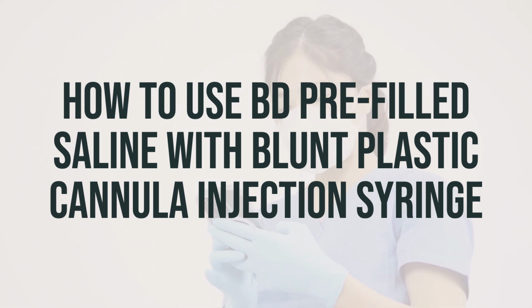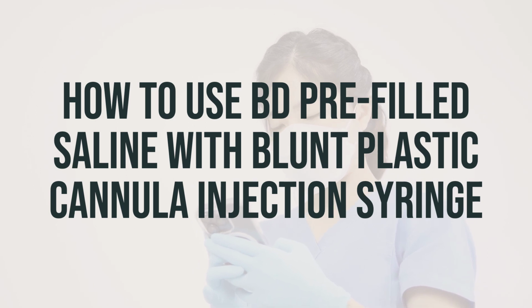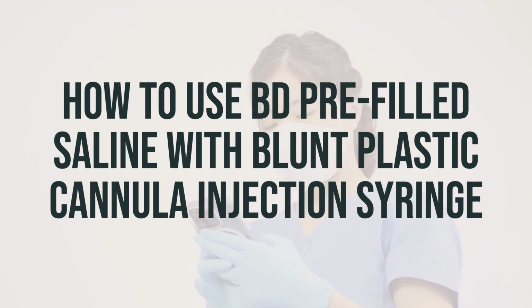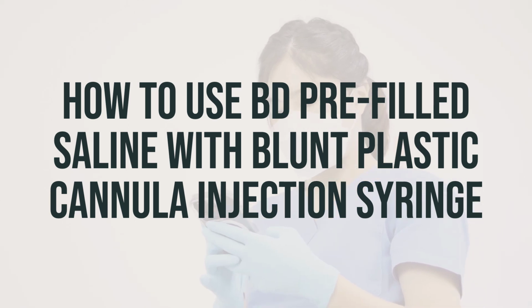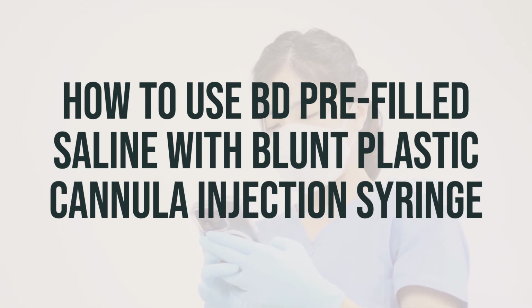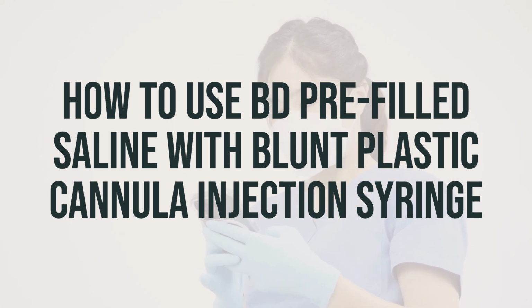When using this product at home, it's important to follow the instructions provided by your healthcare professional. Before using the syringe, visually inspect it for any particles or discoloration. If you notice either of these, do not use the liquid. Make sure to learn how to store and dispose of medical supplies safely. It's important to use this medication regularly in order to receive the full benefits. Try to use it at the same times each day to help you remember.